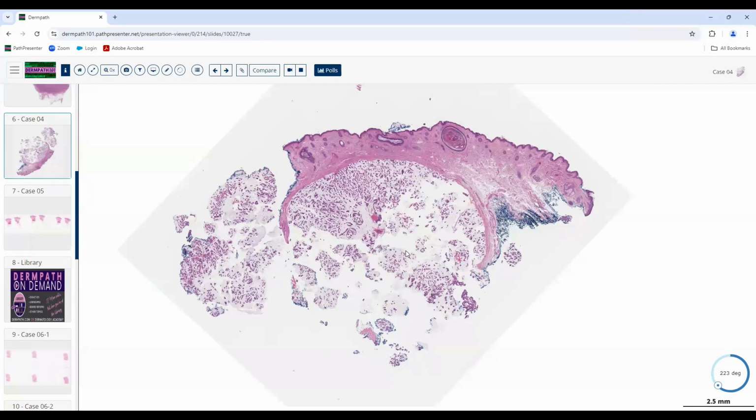Not as much as you already mentioned. Like I said, the epidermis and the superficial dermis look very benign in nature. So it's really what's inside that entrapment that's the big feature. Okay, good. You've got these cells over here, but is there anything else you notice? Don't overthink it. Just dial back and say, what kind of color do you see? Describe it to a 5-year-old kid, for example.